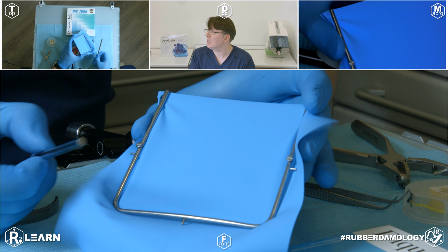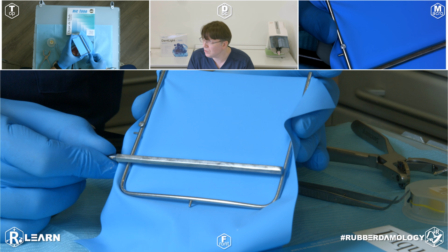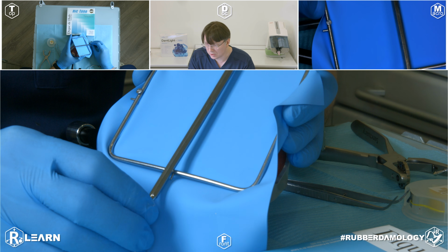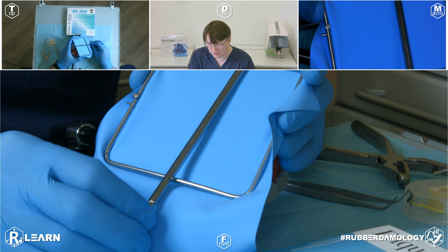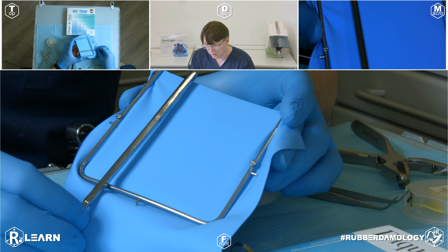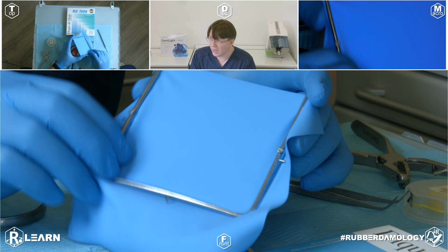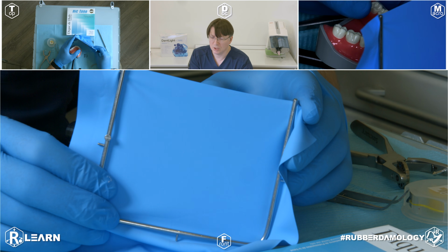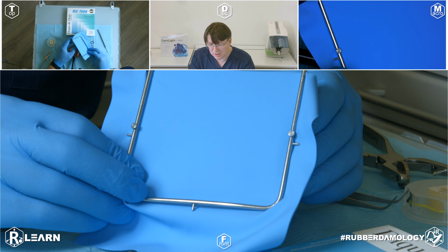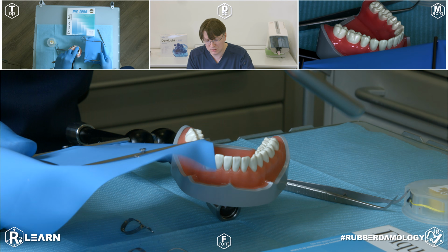What area can we make perforations in our rubber dam? Below this line is for the lower jaw. At the center line for incisors and canines. At the middle of this part for molars and premolars. I spent one separate lecture to discuss with you all aspects of template-free rubber dam markup. But today we made just a very fast isolation.